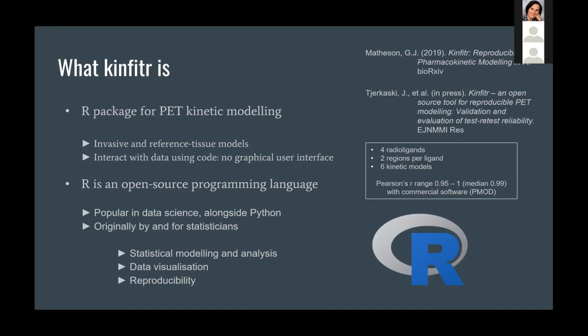I might also mention that the student who did this, Jonathan Cherkassky, was in fact a medical student with no background in programming, and was able to, working part-time, pick it up in a couple of weeks. So the requirement of interacting with data using code is not as insurmountable as it might seem.